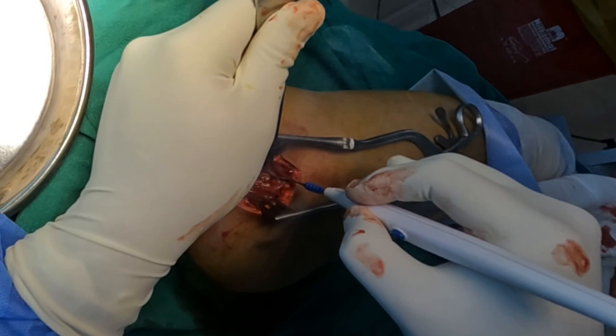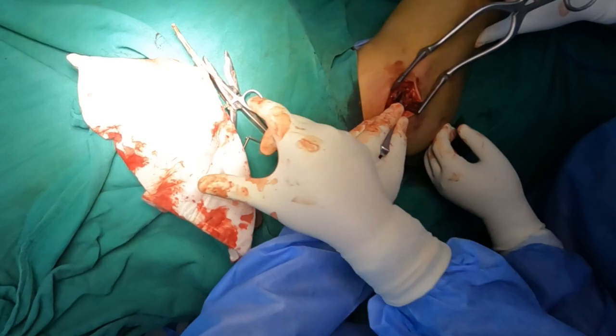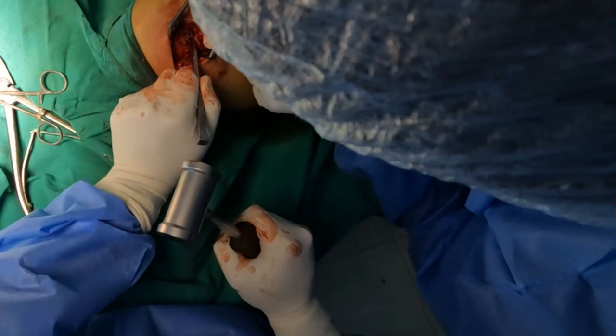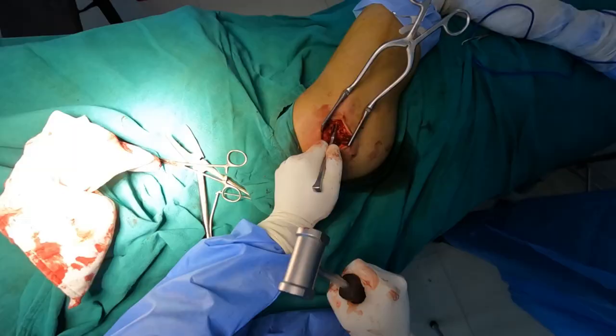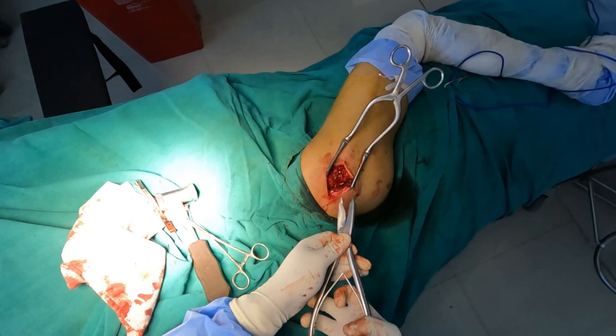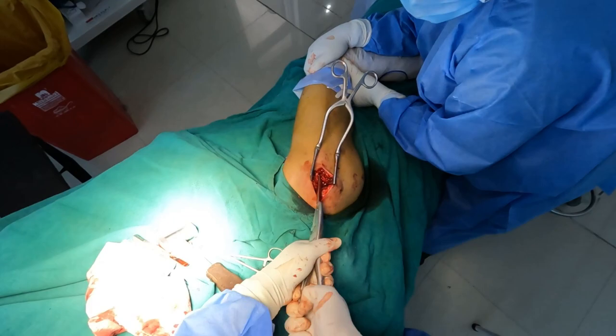I am using a cautery to clean the soft tissue accumulated around the K nail. Now I am making use of an osteotome to expose the tip of the K nail in a better manner. Once we do that, I am using a plier to take hold of it and have asked my assistant to give counter traction by holding the leg. I am pulling the K nail and luckily it came out, but now it has got stuck.